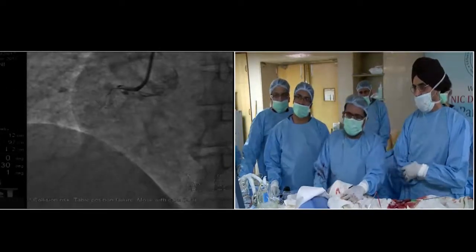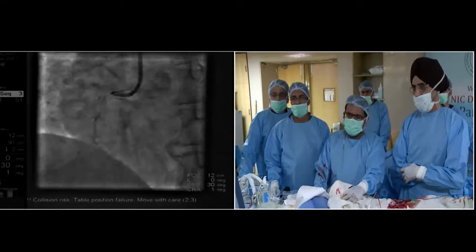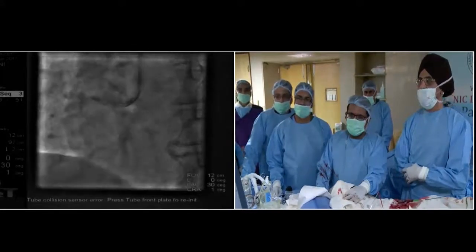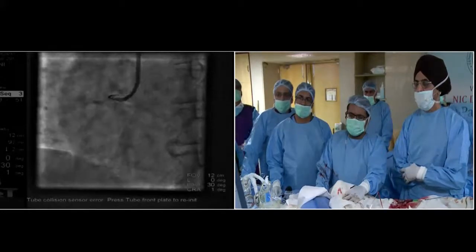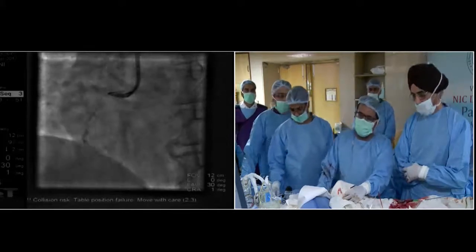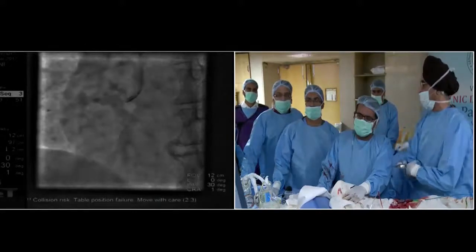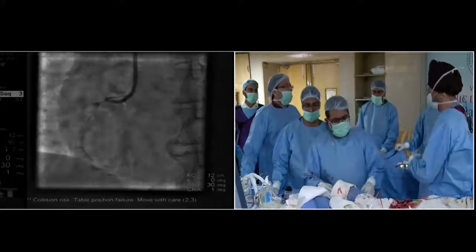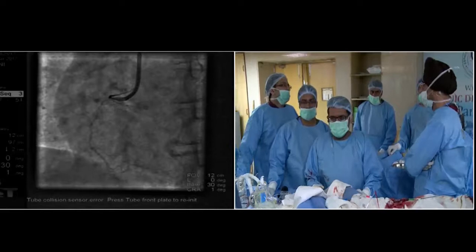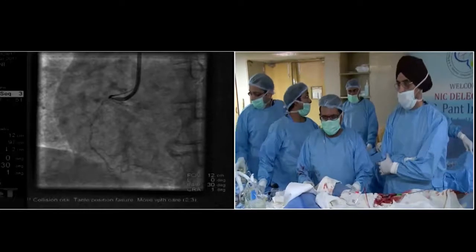I would open it to the panel to have their thoughts. Are you using any support devices like microcatheters? Because this is a vessel that has a lot of disease and is tortuous, so you need support with a guide and you need some accessory devices. Probably a microcatheter will help you to cross. Right, pure wire alone would not be successful. Changing the guiding catheter, I agree with you. We have changed to an Amplatz guiding and I'm now taking a microcatheter with the guiding catheter. That's the only way I will be able to get it. Take a strike.